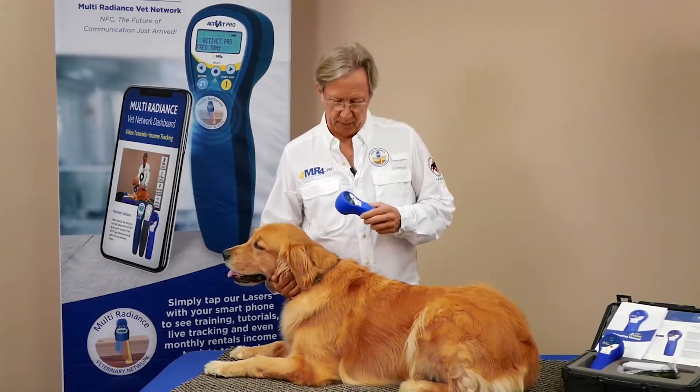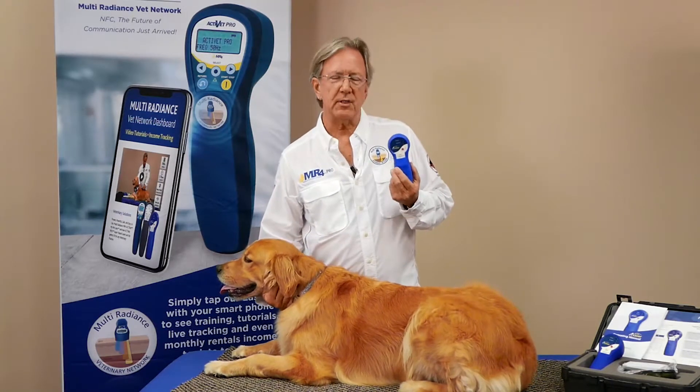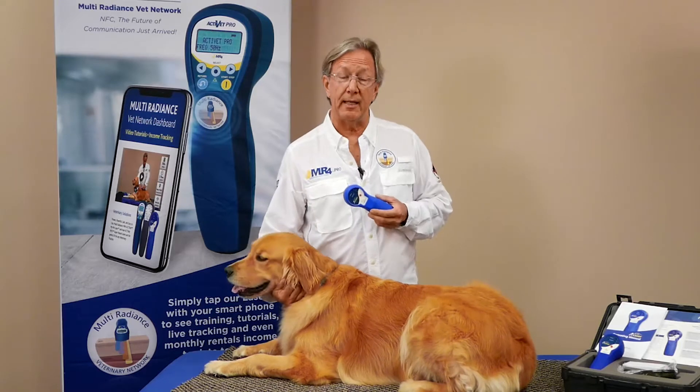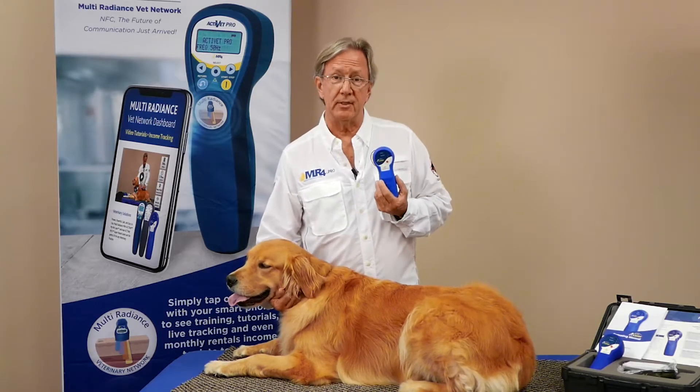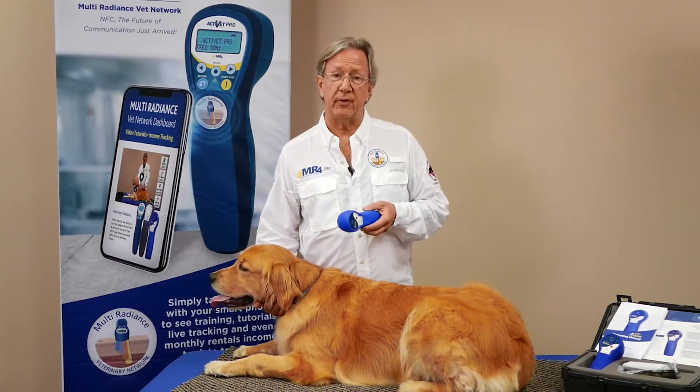Welcome back to our MyPet laser network. We're going to show you the different protocols to use with the MyPet laser — the first laser powerful enough to get great results but safe enough to send home with your clients for them to perform laser treatments at home. It makes a huge difference in the continuity of treatments for things like arthritis.